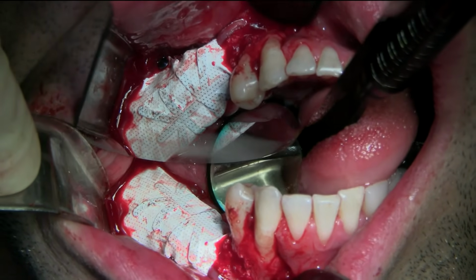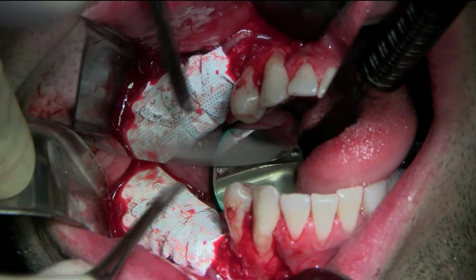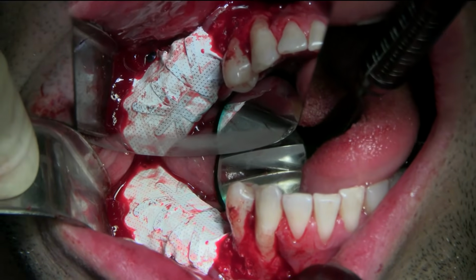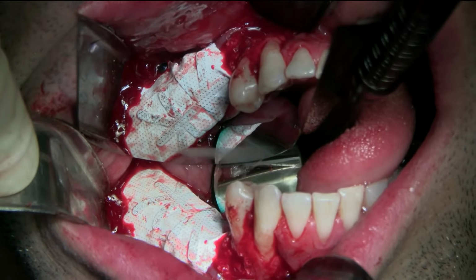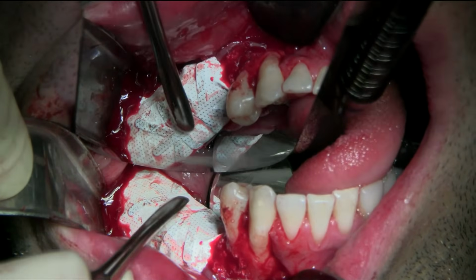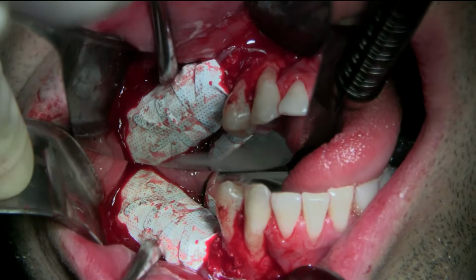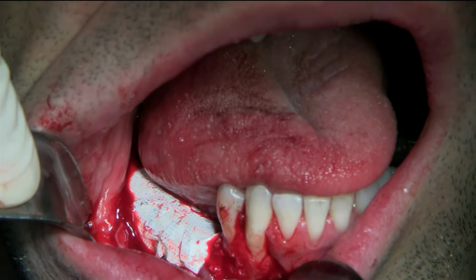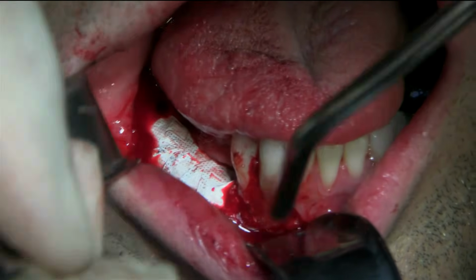Okay, you can see it's really nicely stabilized. It wasn't easy, but we got it, and you see the width. So once we get this done, the width will be such that you could easily place a 4mm implant diameter, maybe even go bigger. But first we have to get there. So that's good. So let me have the membrane. Yeah, that's good.